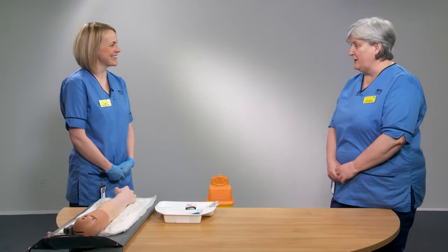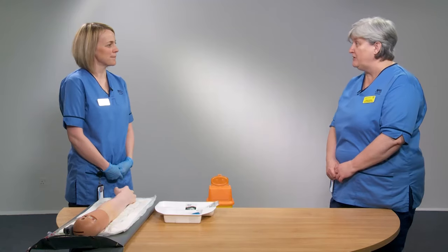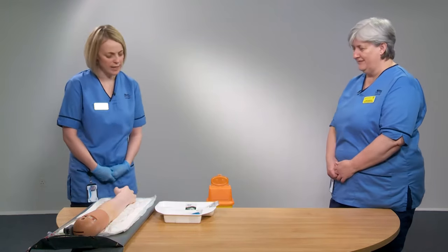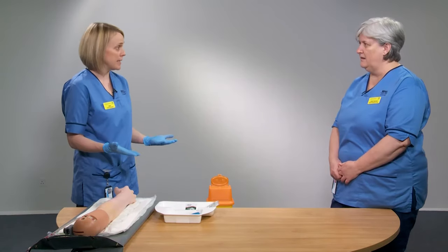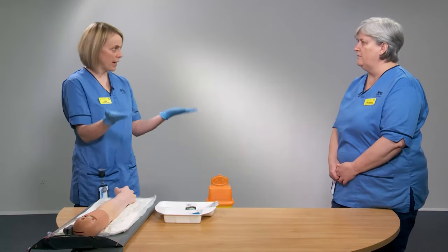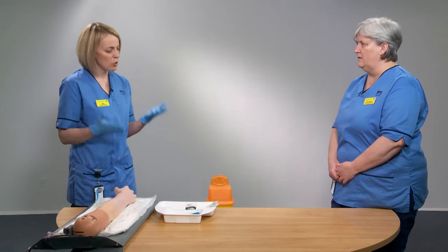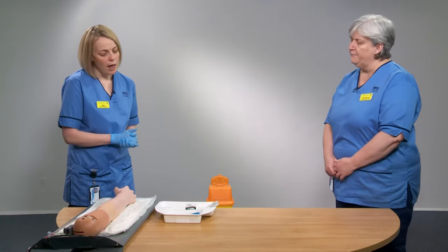Thanks for coming along today. Kate is going to demonstrate the venipuncture technique used in our health board. The first thing to think about is PPE — normally a white apron and blue nitrile gloves. For this demonstration, we'll just use the blue nitrile gloves.